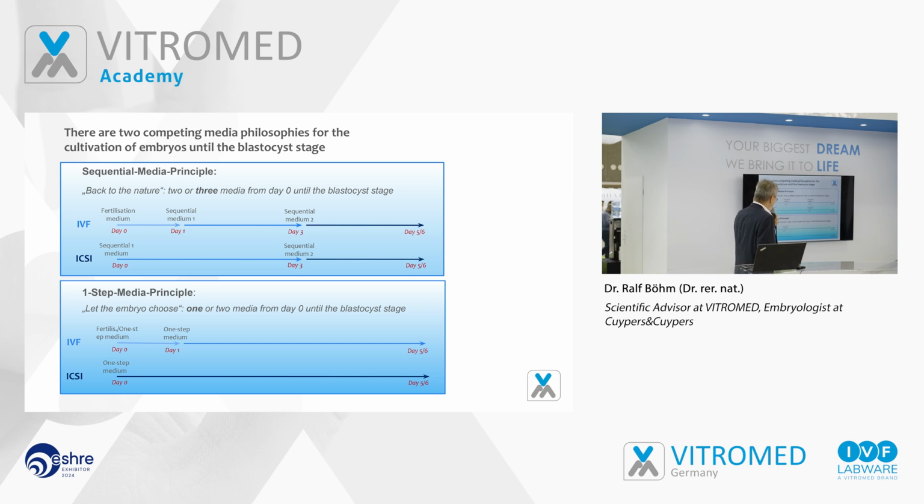The second principle is the one-step media principle. It's based mainly on the work of John Biggers. And the philosophy behind this is: let the embryo choose. The embryo is swimming in a drop where everything he needs is available, like a supermarket. So it's up to the embryo itself to take what he needs for his development. Now, this is quite easy to handle.